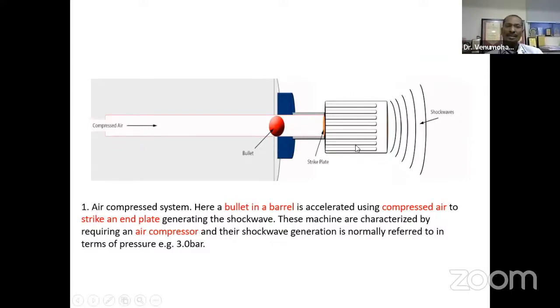This requires an air compressor. And since this is using air for producing and accelerating, it is measured in bars.